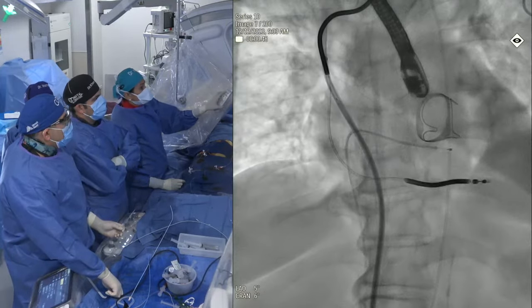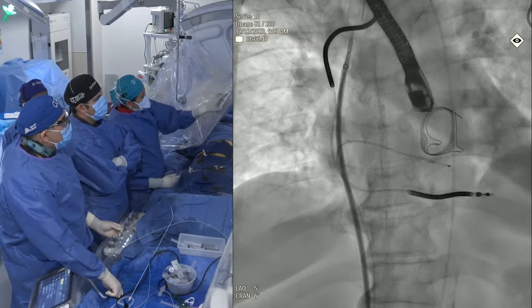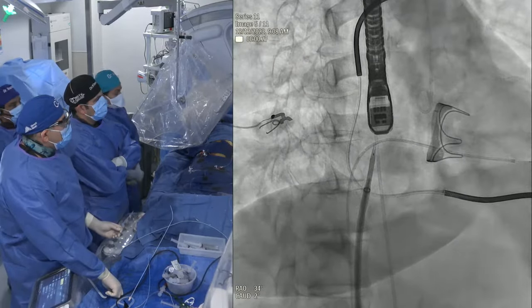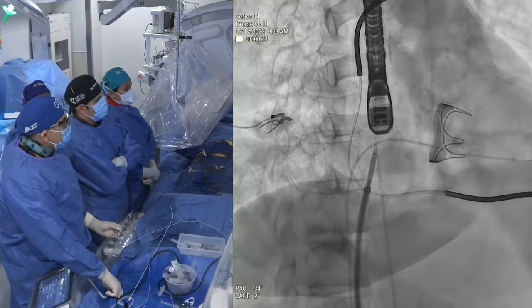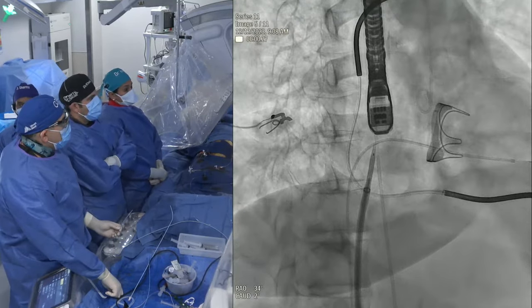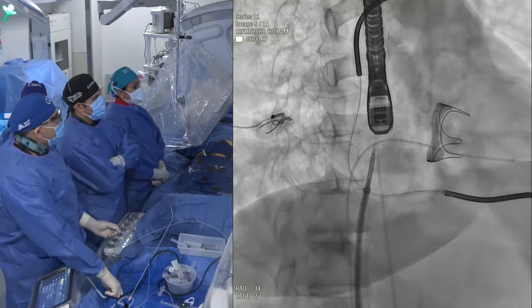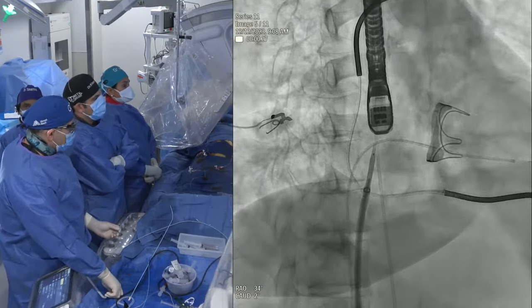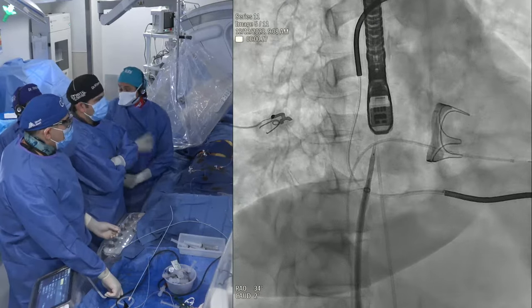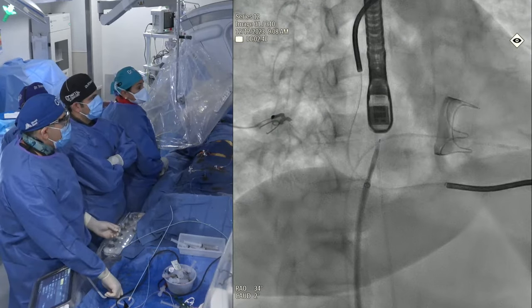The usual, if you see here, we start coming down exactly where we think we are ready. So if you see the prosthetic mitral valve in the RAO view, you draw a line where you are half. This transseptal should be just at that level, and as much as you go posterior to one Sapien valve. Further? Okay. Yep. So that's where we did the transseptal.